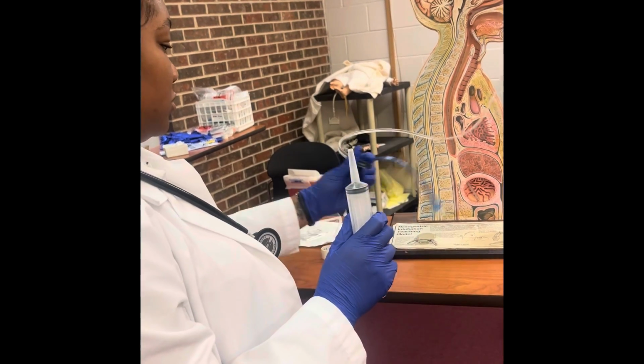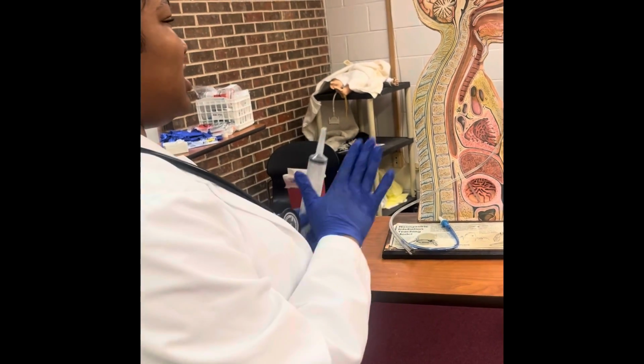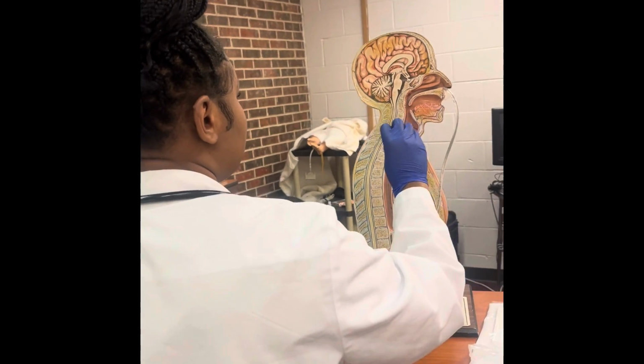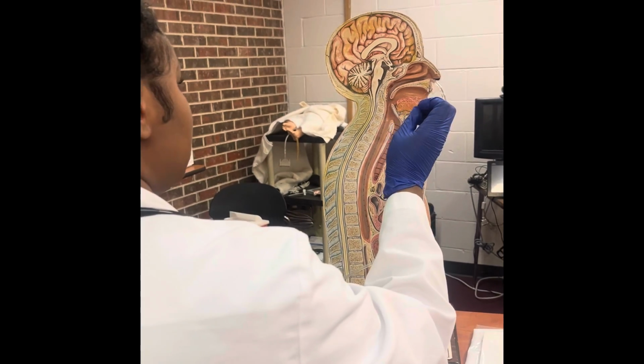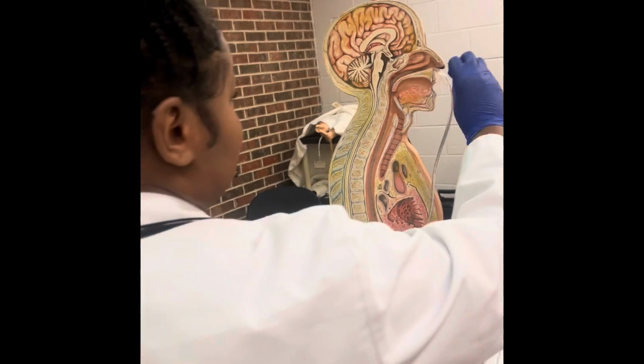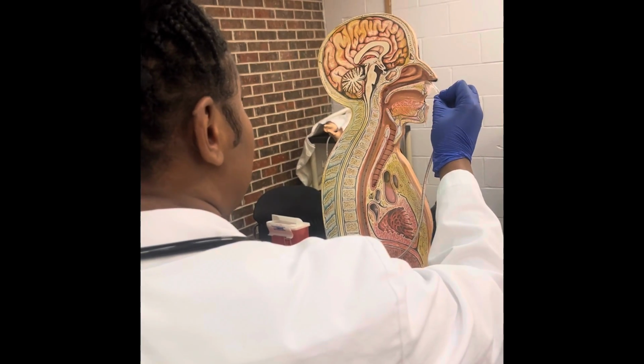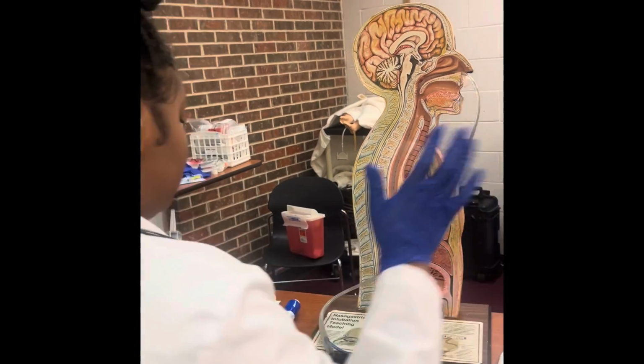And then for routine care of an NG tube, at any time a person has an NG tube, we will make sure to be checking the site, the nose, every single day. We can see if the tape is soiled, if it needs changing, if there's any leakage from the nose, or if the nose looks dry, we can apply some moisturizer.